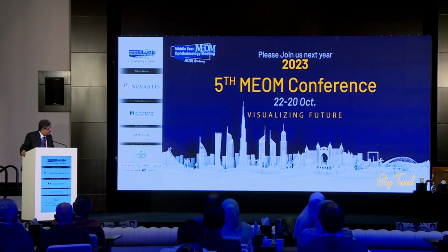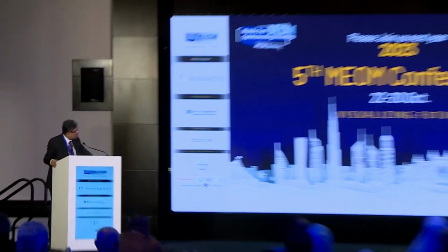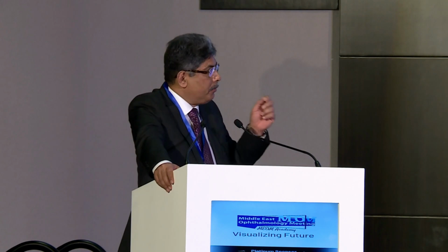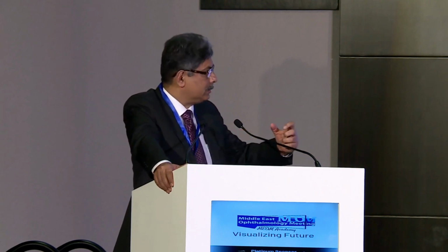Thank you very much for the excellent presentation. We can discuss now. You said in your summary that when you have a posterior capsule opening and it's a soft nucleus, continue phacoemulsification. Yeah, the thing is that you have to look whether your phaco piece is engaged at the phaco tip and you have visualized the rent. You complete that piece which is engaged at the phaco tip, and then you push the viscoelastic.